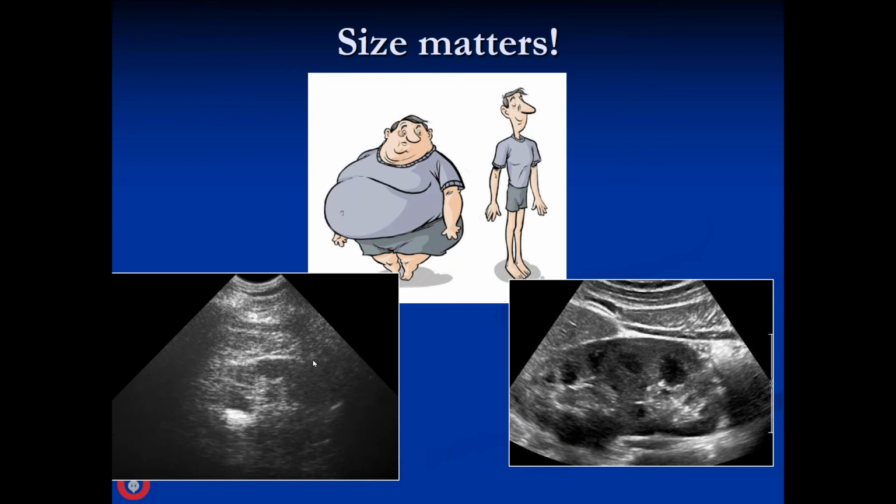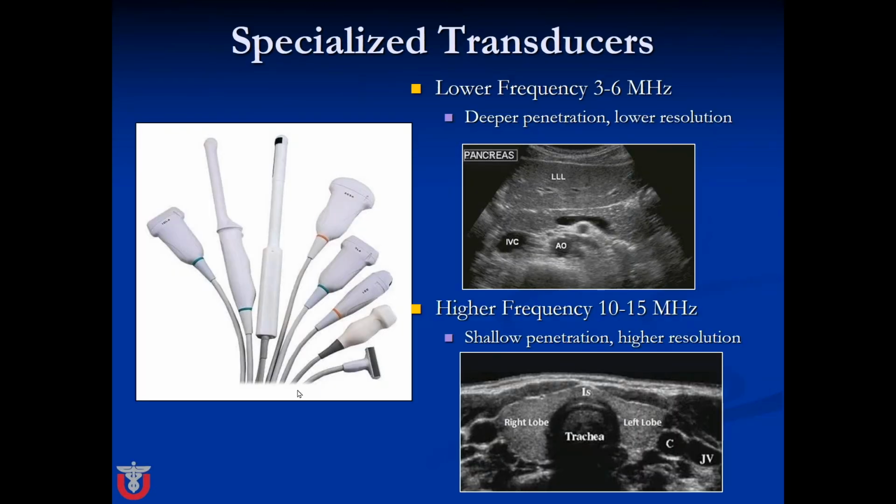Look at the obese patient over here. This is the kidney down there. I can barely tell you there's a kidney there, let alone if there's anything wrong with it. All right? So think about that when you order scans on patients.